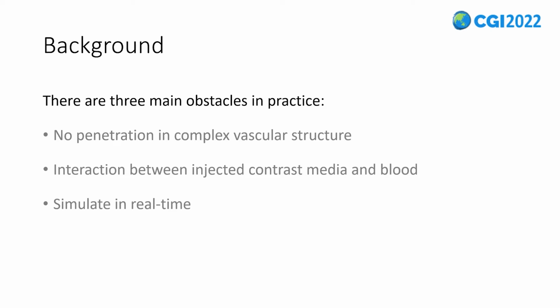Despite years of progress in contrast media simulation, there are still three main obstacles in practice. First of all, the flow simulation in blood vessels should correspond to the actual situation as closely as possible without penetration, and have good robustness for complex human blood vessels with different radii and curvatures.